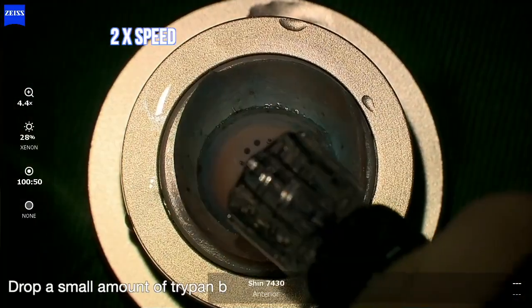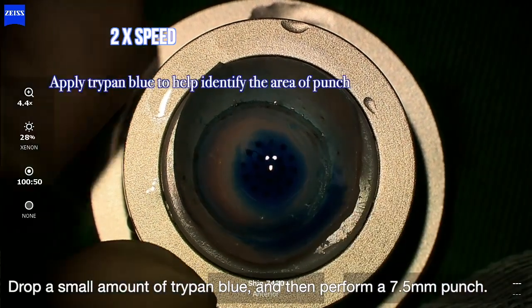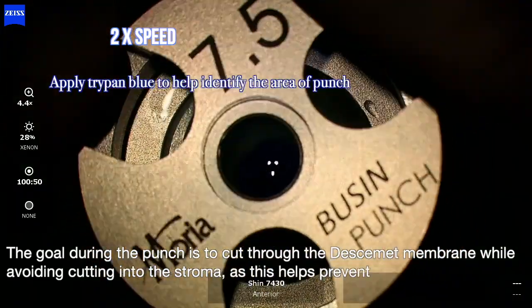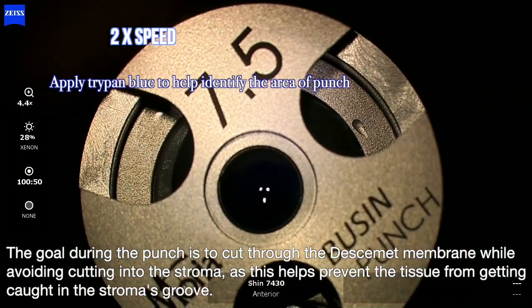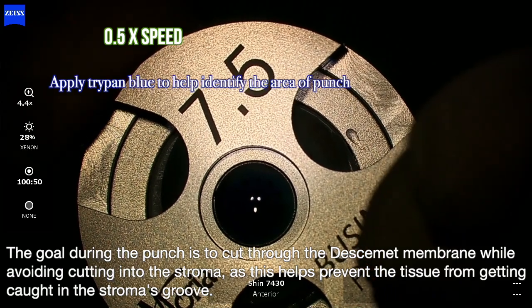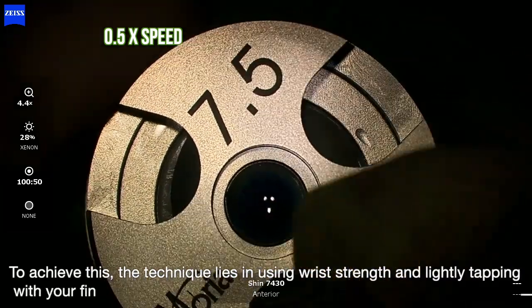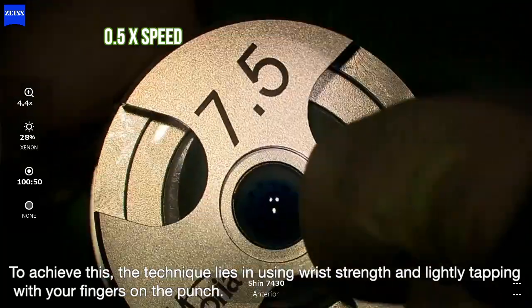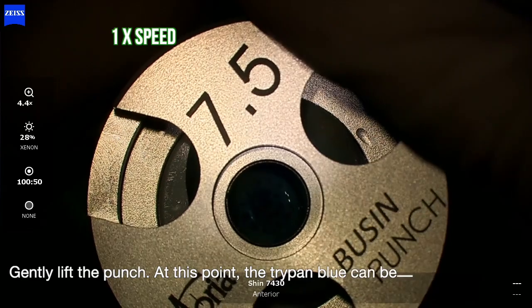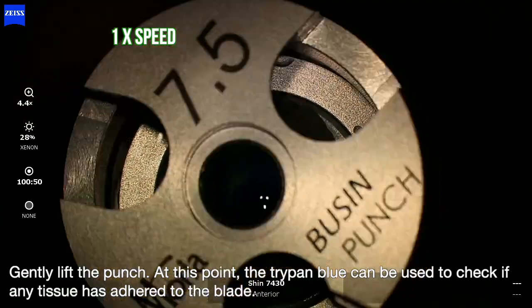Drop a small amount of trypan blue and then perform a 7.5 mm punch. The goal during the punch is to cut through the Descemet membrane while avoiding cutting into the stroma, as this helps prevent the tissue from getting caught in the stroma's groove. To achieve this, the technique lies in using wrist strength and lightly tapping with your fingers on the punch. Gently lift the punch.